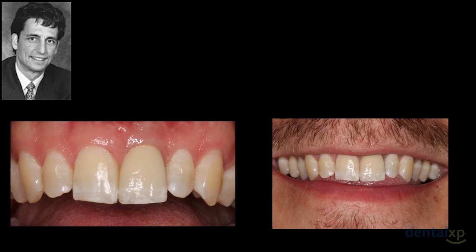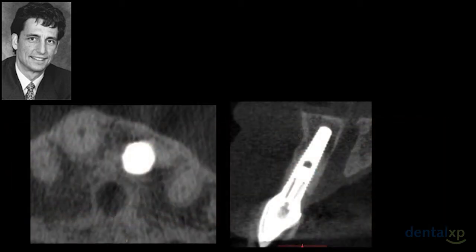So I think if you look at the side views, you'll clearly see that we have very little scarring and we've got an excellent outcome. There was a slight amount of composite that was added due to the shape of this tooth. Tooth number 8 was definitely triangular in shape, which, as we know, looking at the aesthetic risk profile, makes a big difference. So we had discussed that prior to with the patient because that was anticipated. But even with these kinds of incisions, we can still get a very aesthetic result with a very predictable outcome.